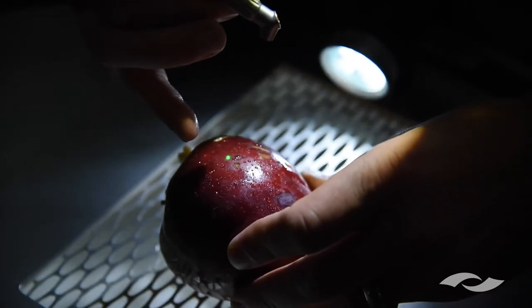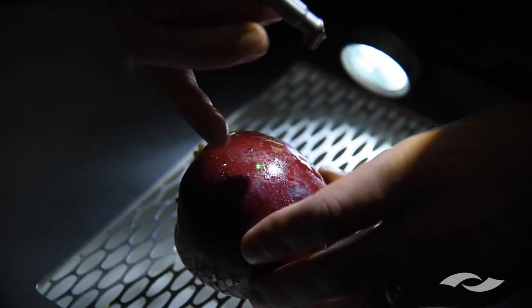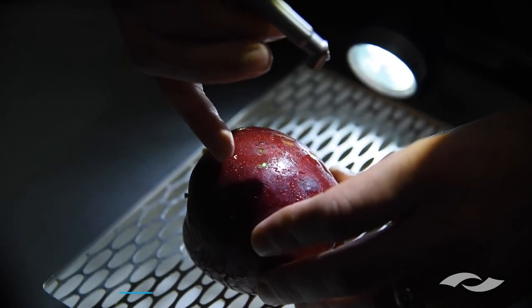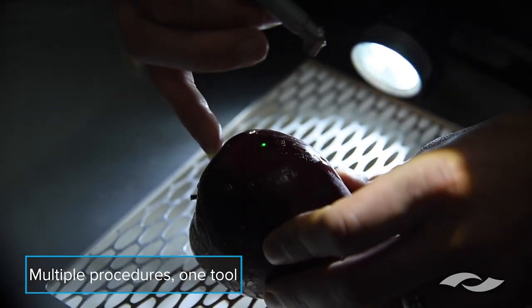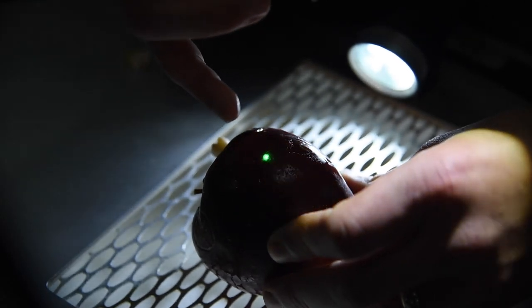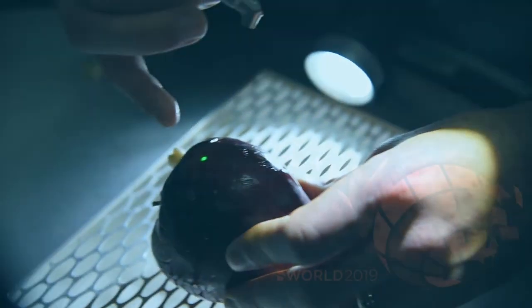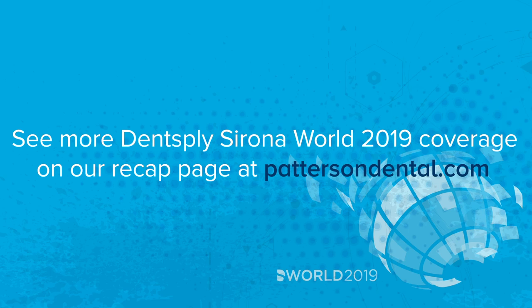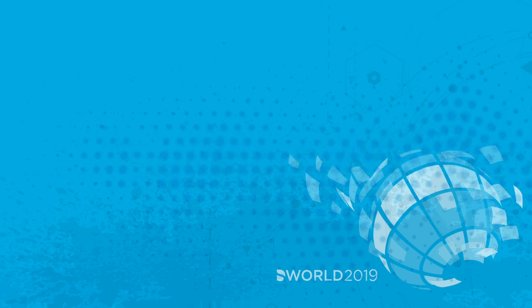This opens a door for efficiency — being able to go from cutting enamel, cutting dentin, cutting caries, and doing a gingivectomy all with the same instrument. It really is a very impactful thing and what it can do for your practice. Thank you very much.